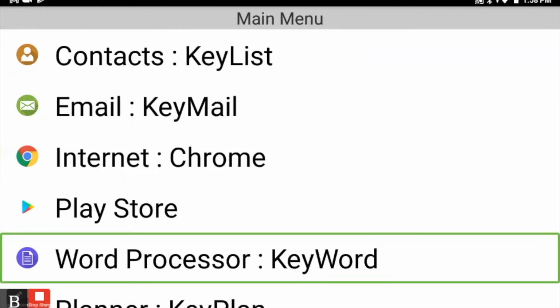Now, not that that's necessarily a big deal, but some things I may want to get to might be further away than that, honestly. Okay, now let's say I want to get to word processor quickly. Well, I know that word processor starts with the letter W, right? So rather than scrolling all the way to word processor by pressing my scroll command, whichever one of those three you prefer, rather than pressing it 3 or 4 times, I could have simply pressed W.